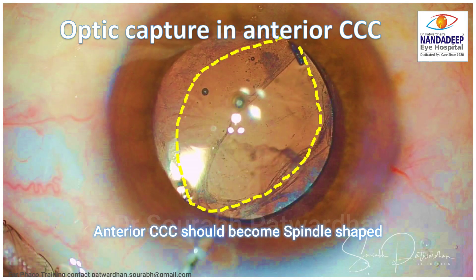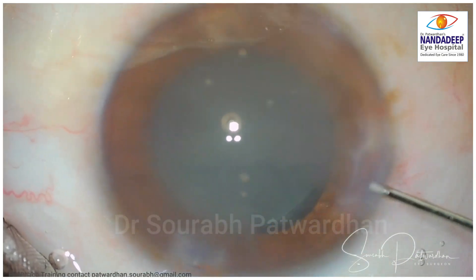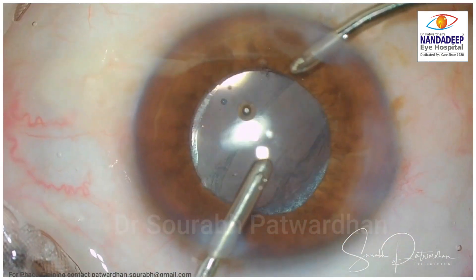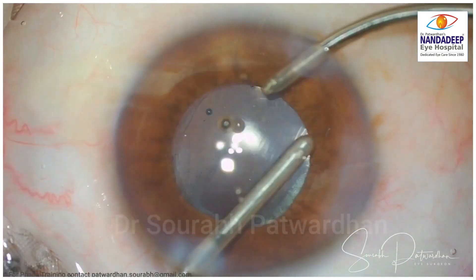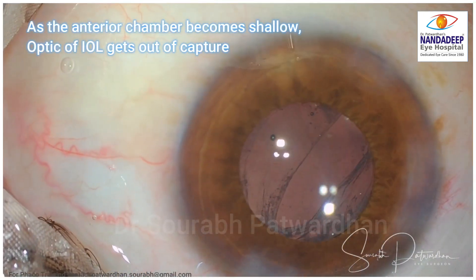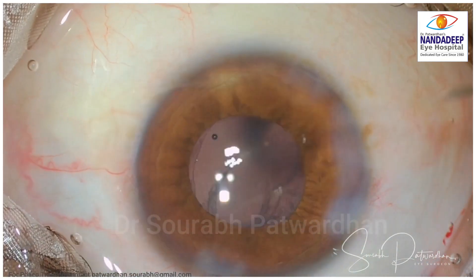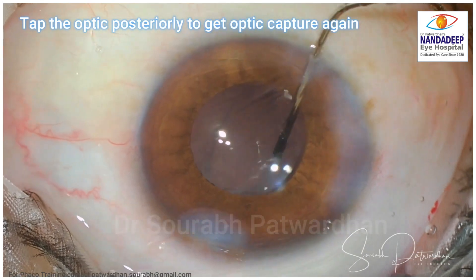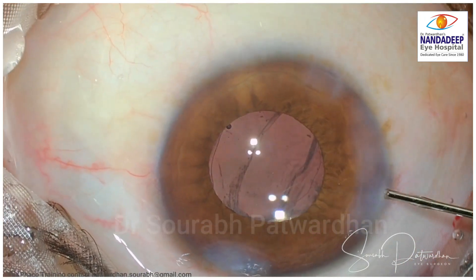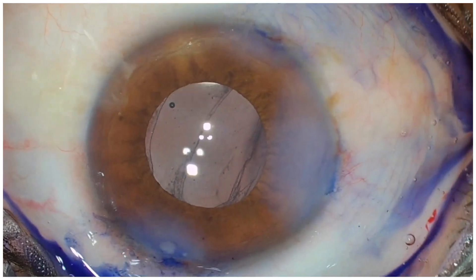Check for any residual vitreous with diluted triamcinolone, and once the viscoelastic wash is done, remember that if there is anterior chamber shallowing after optic capture the IOL may come out, so make sure at the end that optic capture is still maintained if the AC collapses in between. Always ensure wounds are watertight and, if needed, suture the incisions.